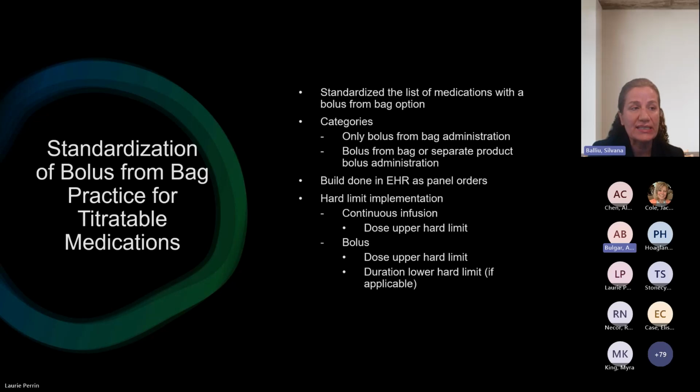For instance, the clinician needs to administer a bolus dose for fentanyl, and the only line available is the epinephrine that is running. If you administer the fentanyl bolus dose rapidly, it will also push the epinephrine at the same rate.